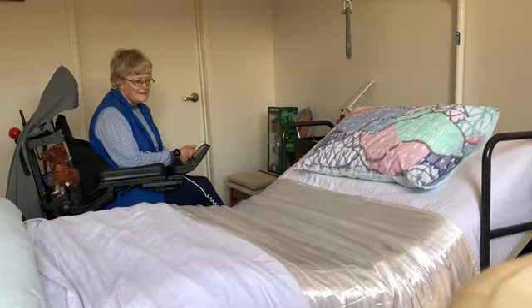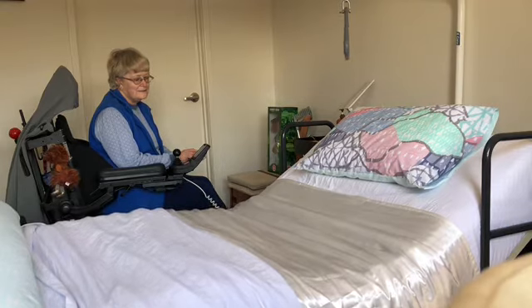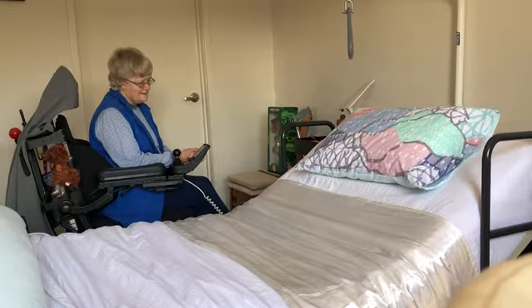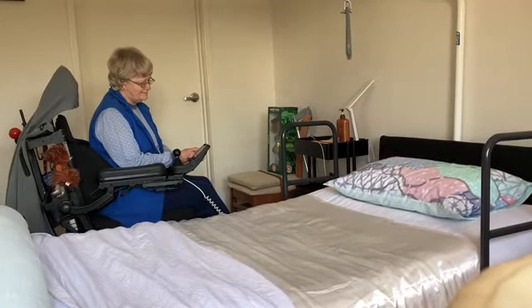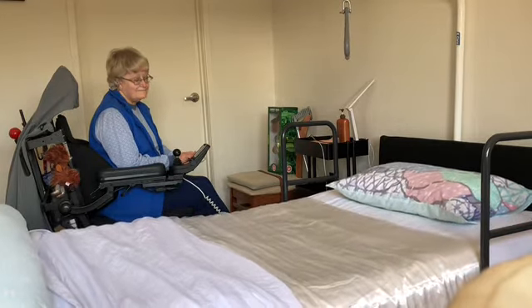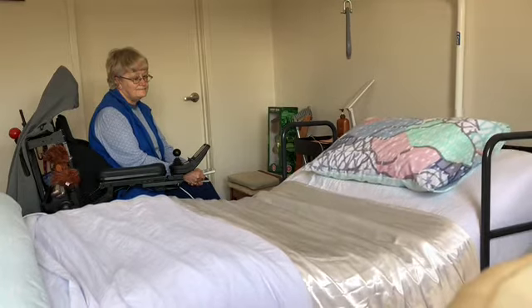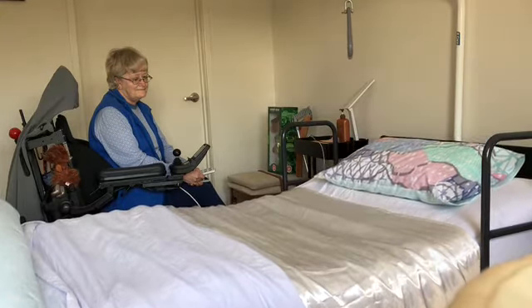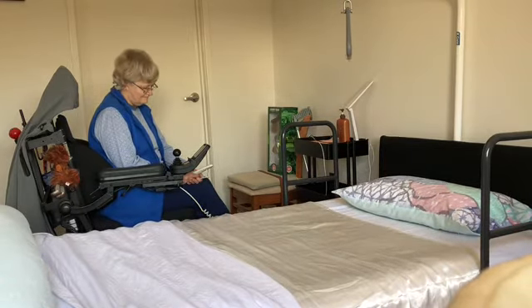Now I can raise the knees up — the part of the bed — so that I'm sitting in a more comfortable position. I'm in a sort of curve which is a lot more comfortable when you have to sit up for a long time. And it can go down flat again. With this control I can sit up and raise the knees up at the same time, which makes it easier for sitting up if I'm not getting out of bed, or if I want to sit up and do some puzzles or read.